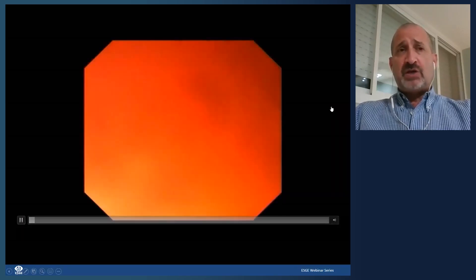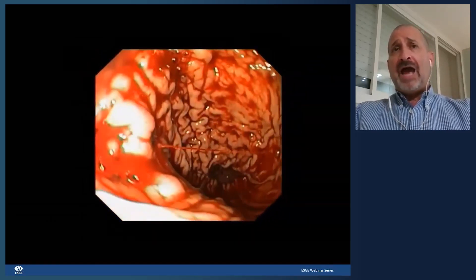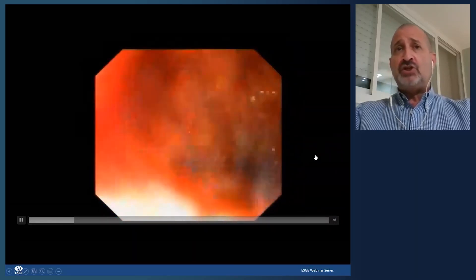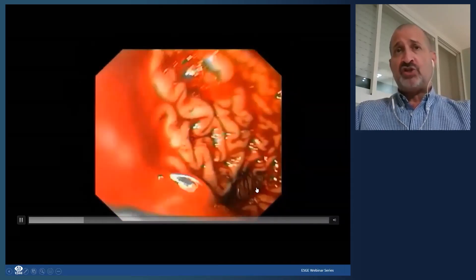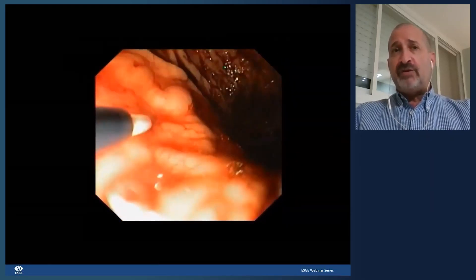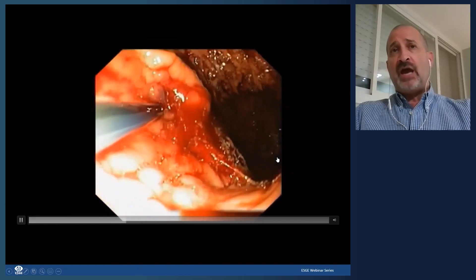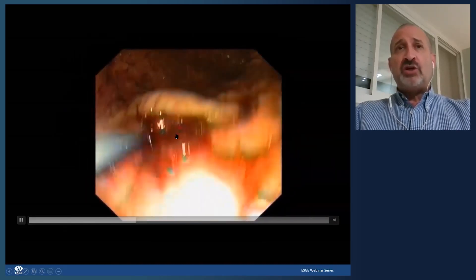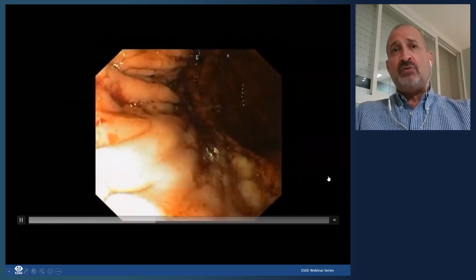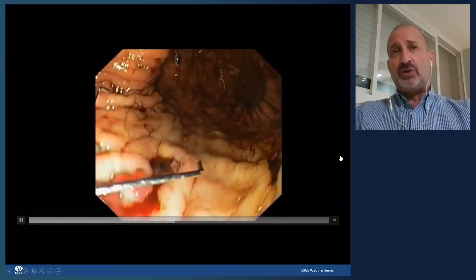This shows how important dilute epinephrine can be. With another actively bleeding gastric ulcer spurting so much, you can't even tell if it's a Dieulafoy lesion or an ulceration. Using combination therapy and injecting epinephrine around the area slows the active bleeding. Suddenly you can clearly see there really is an ulcer — and you can treat it with a through-the-scope clip to close the area.